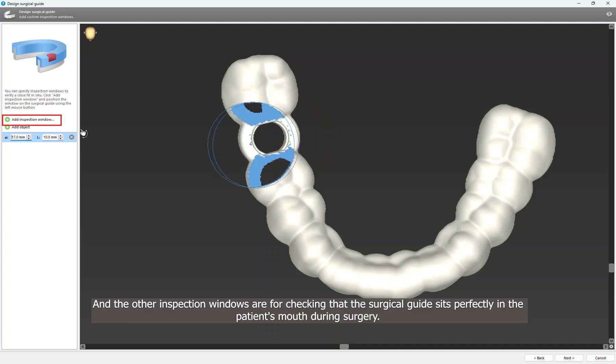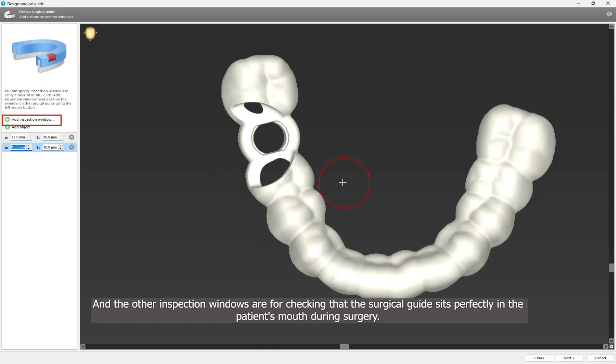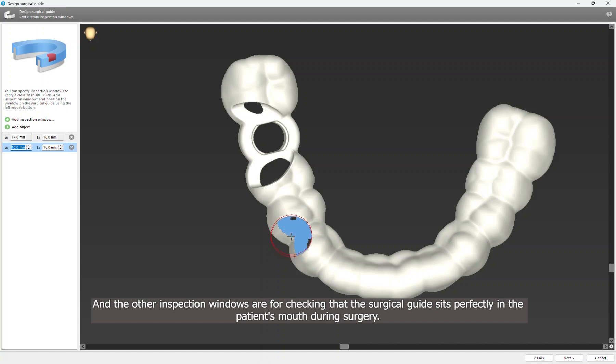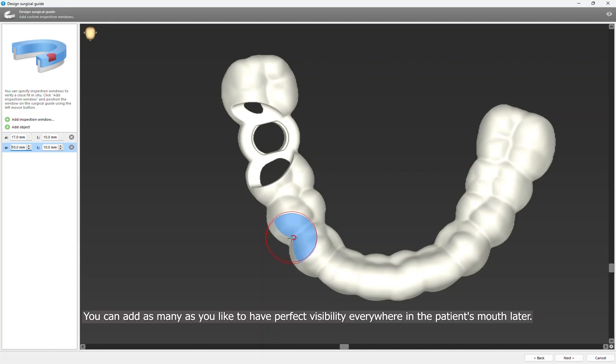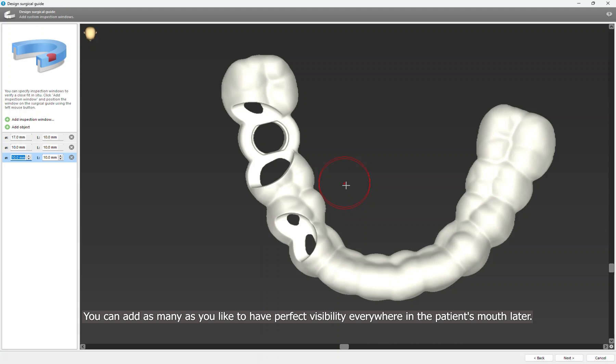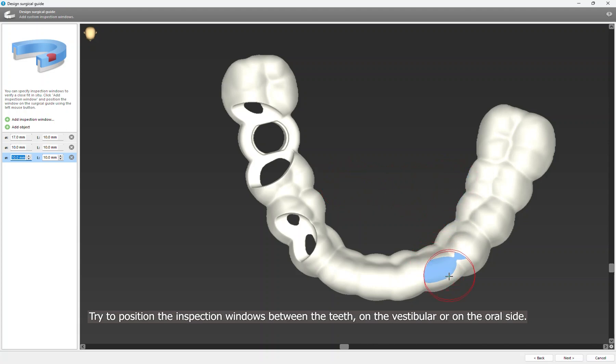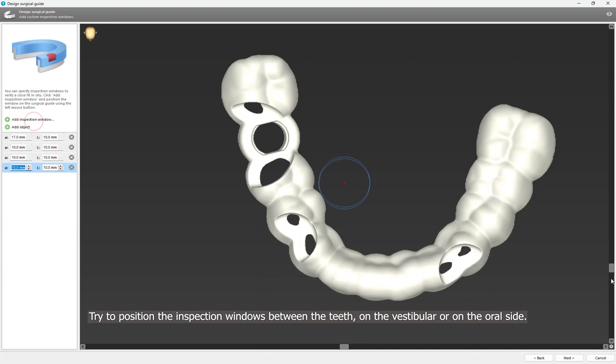And the other inspection windows are for checking that the surgical guide sits perfectly in the patient's mouth during surgery. You can add as many as you like to have perfect visibility everywhere in the patient's mouth later. Try to position the inspection windows between the tooth on the vestibular or on the oral side.